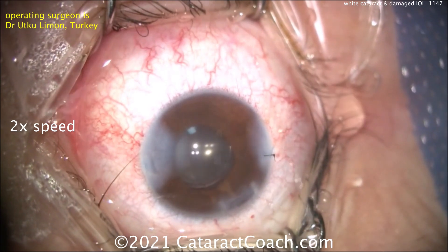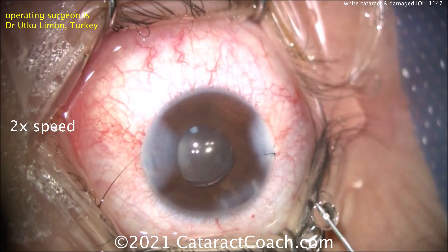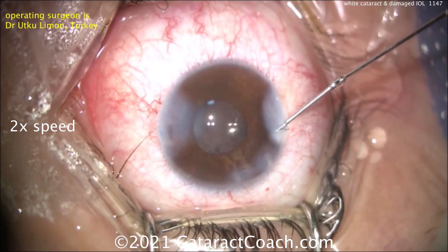Now at the end, remember that young people have more elastic corneas — you've got to take your time, make sure all the incisions seal up, and if you need to, as you see here, place a suture.